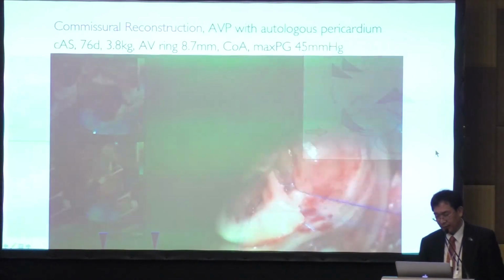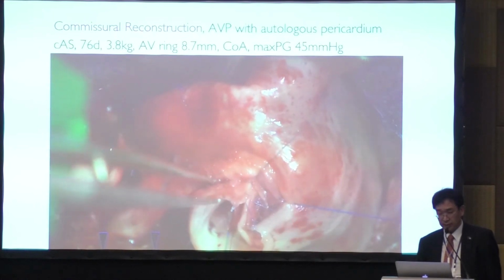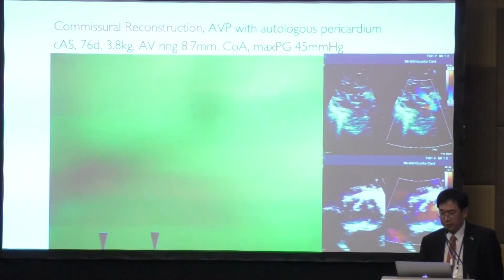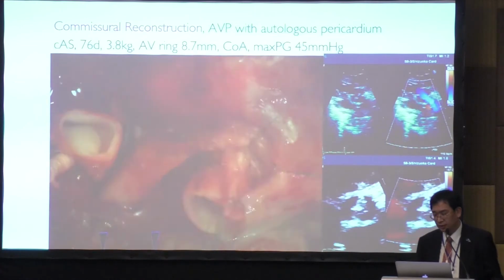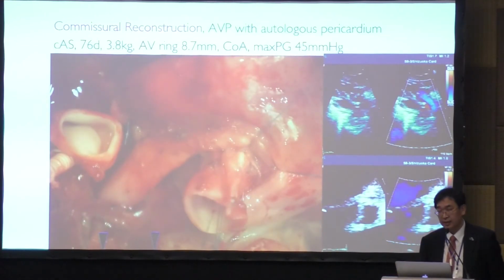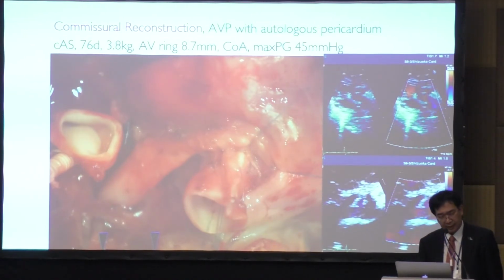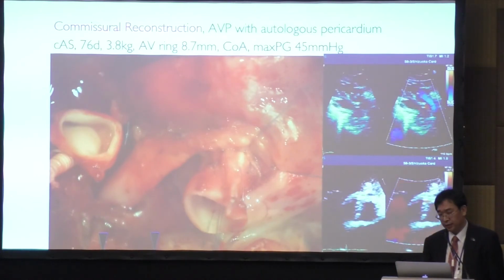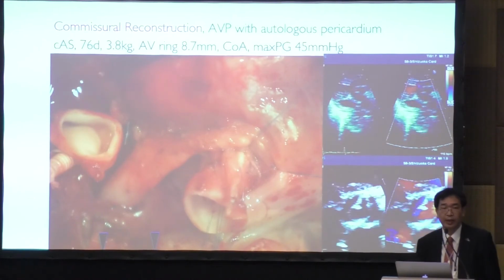You can see. Anyway, so close this one. This patient had a reasonable ascending aorta, also reasonable acceleration within 2.5, and no regurgitation. This patient is now around 3 years out, with no regurgitation, and the pressure gradient is a little bit increasing, 3 to 3.5 now.